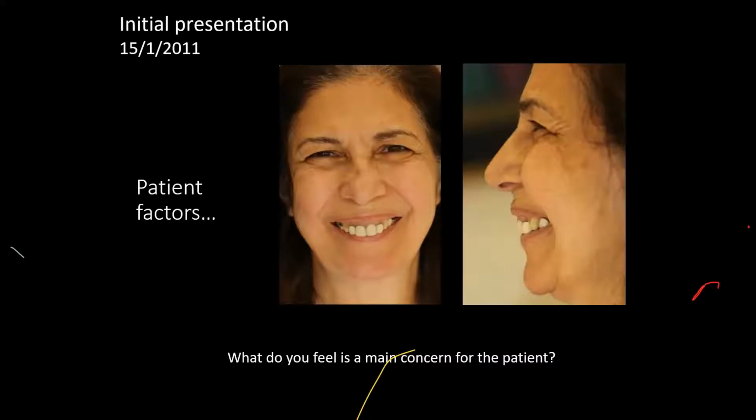I mean, naturally, all the patients are placed on the articulator and assessed. But even before we place on the articulator, we have to look after perio, endo, caries control, overall gum and bone health, temporize. Well, before the temporize, you can mount it on the articulator because then you have the right position. And naturally, we like to maintain the existing bridgework to be able to get the initial vertical dimension. Then we can open up if we need to. But I don't need to open up on the articulator, the diagnostic wax up, because there's other ways of doing it.